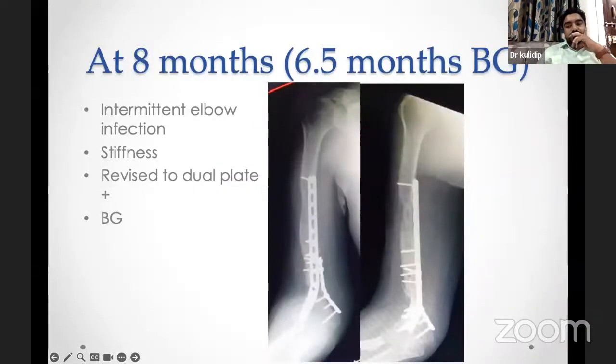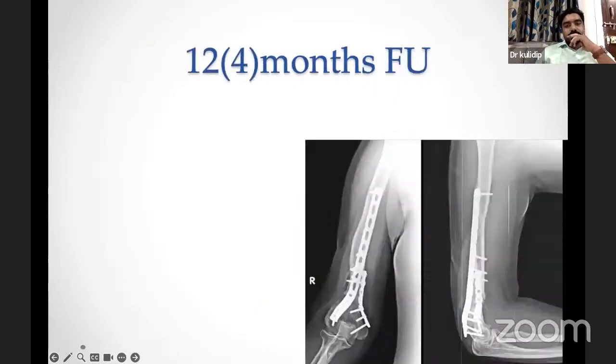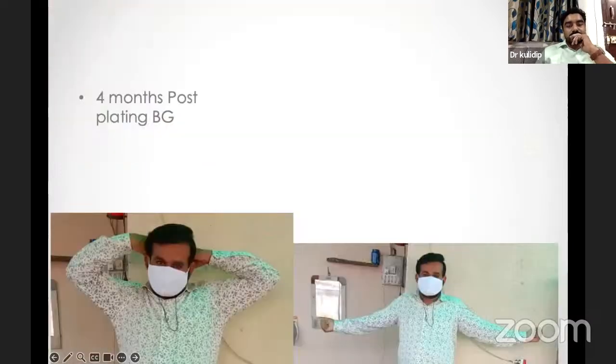So at 8 months, and probably 6.5 months from the previous grafting within the rings, I did a dual plating and bone grafting, and went up above the regenerate into the proximal humerus and put in a screw. It was dual plating. At 12 months, you can see the well healing. This is the functional outcome. This is 2 months post plating and bone grafting, and this is 4 months post bone grafting. We are still in contact.